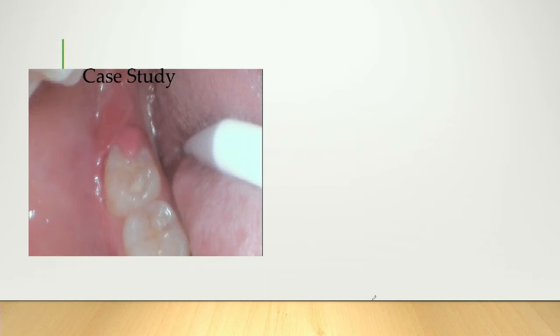there are two flaps mainly for wisdom teeth. One is an envelope flap with a distal relieving incision, and the second is a trapezoidal flap, so a three-sided flap. So when do I decide to do which? Basically, if I can be more conservative, I will. I would do an envelope flap for this case, so basically it goes this way. Sometimes you don't have to curve up the papilla, you can basically just go straight.